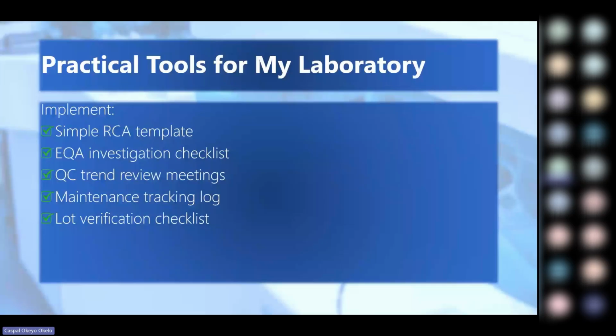My HbA1c failed. I did my investigation. So you don't need expensive software to improve RCA. People say, oh, you have to pay a lot of money for troubleshooting tools or things like that. You don't need this expensive software. You just need a structure. And here are some of the simple tools that will make a significant difference.